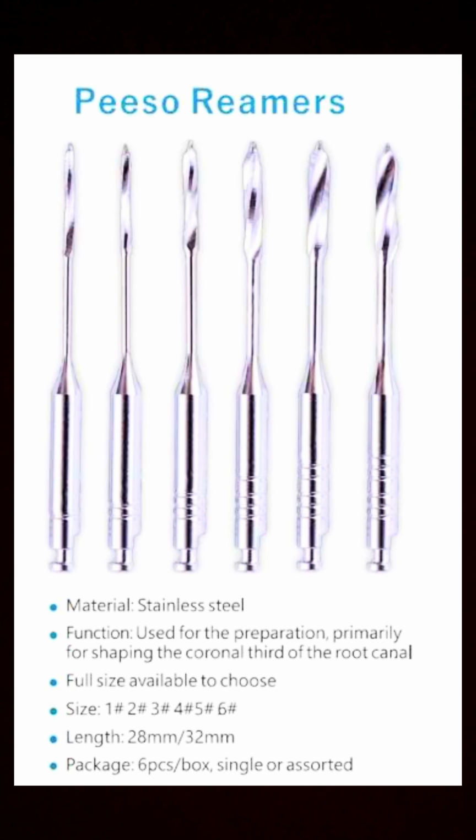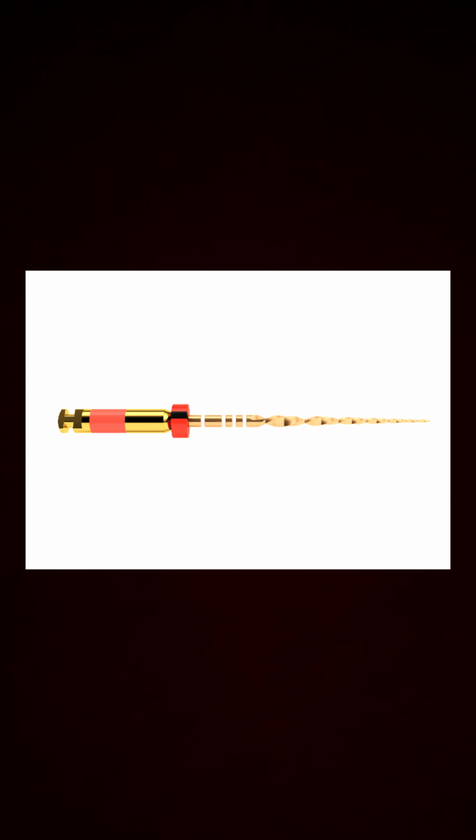What is a reciprocating instrument? It is a technique in which a file moves in an alternating clockwise and counterclockwise motion instead of continuous motion. It is used to reduce stress on the instrument.